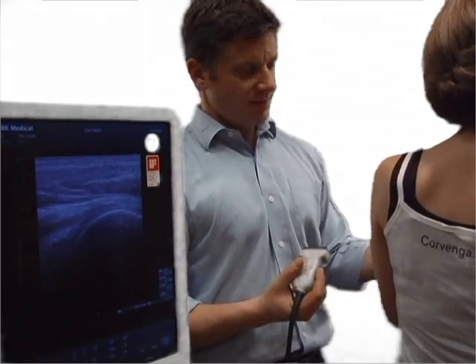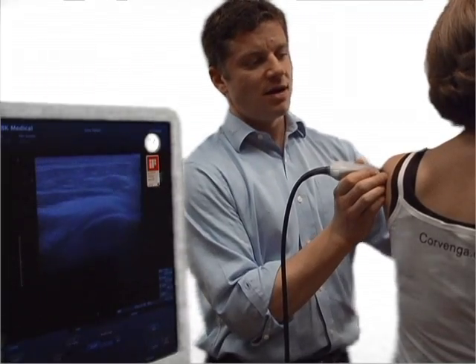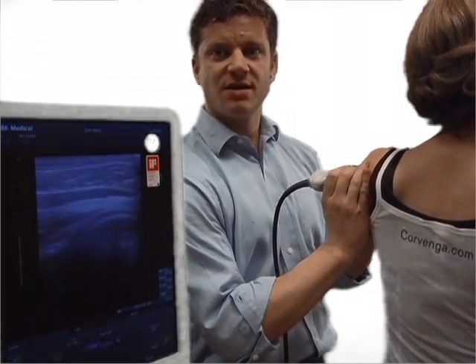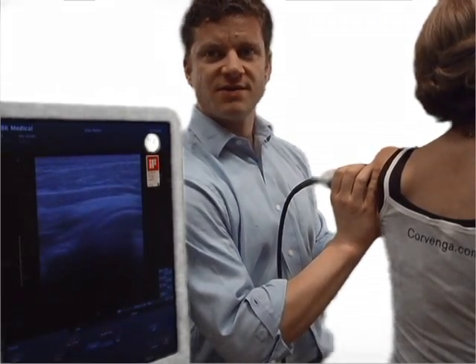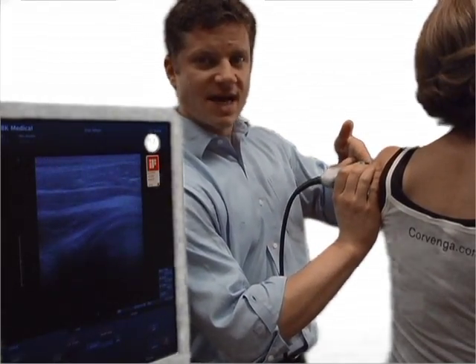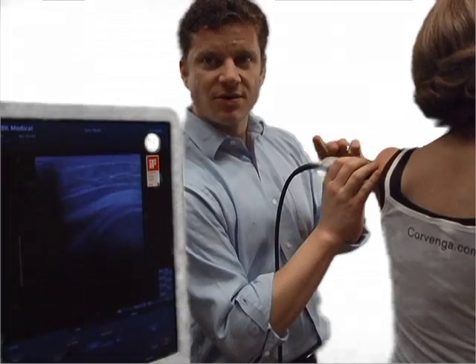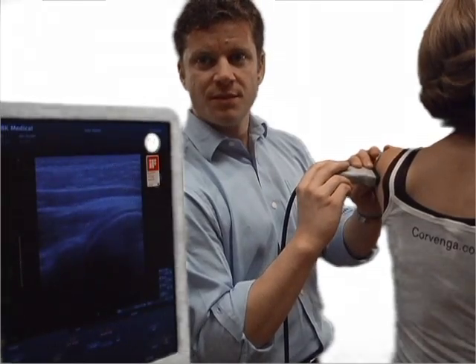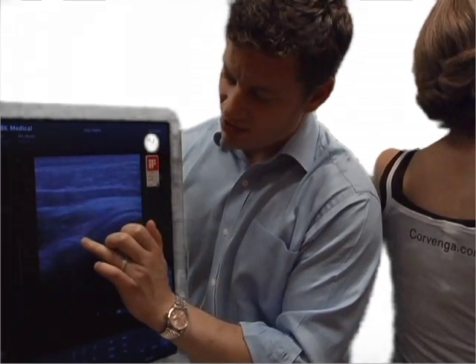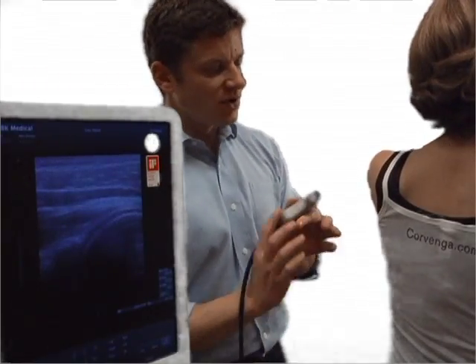Once we've identified the anatomy, we want to have the patient grab the opposite shoulder. This opens up the glenohumeral joint itself, making it a little bit easier to do the injection. Then we're going to take the needle and come in from the lateral side, lining it up in the long view so that we see the tip and shaft of our needle. With this technique, the needle will come over the humeral head and go right into or next to the glenoid — a very nice straight technique for doing a glenohumeral joint injection.